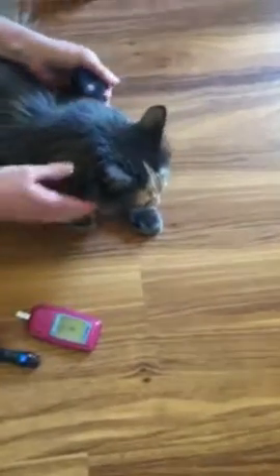I try to keep her in view. Because she doesn't want to cooperate and my other cat just startled her, I do a football hold — and that always calms her right down.